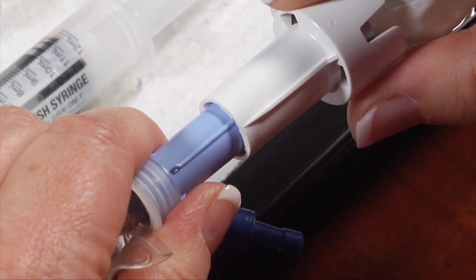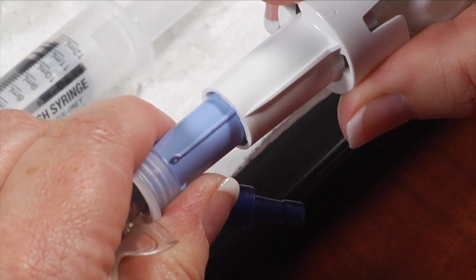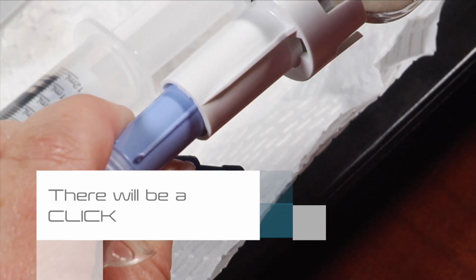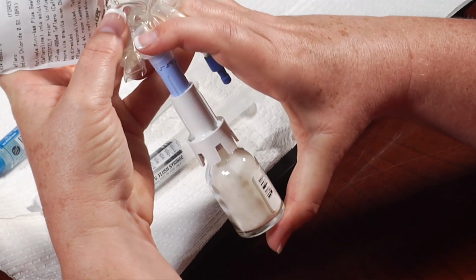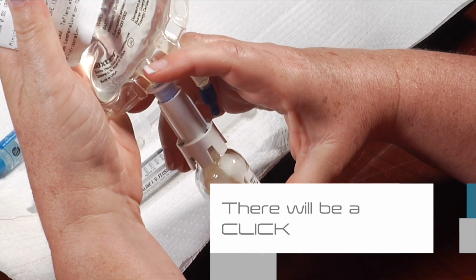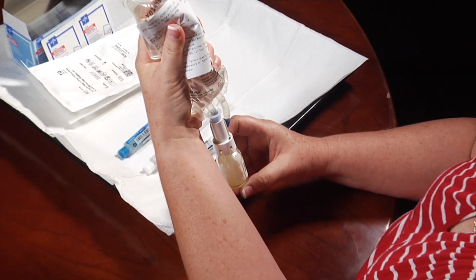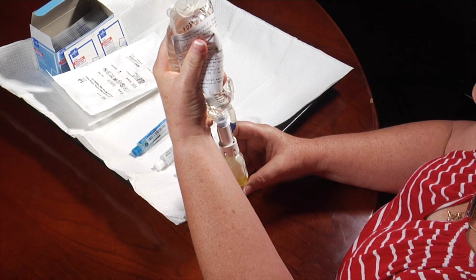To mix the medication, hold the white vial gripper firmly in one hand and the blue port adapter in the other hand. Twist slightly to line up the ribs of the blue port adapter and white vial gripper. Push the blue port adapter into the white gripper. Hold the bag above the vial and gently squeeze the solution until the vial is about half full.